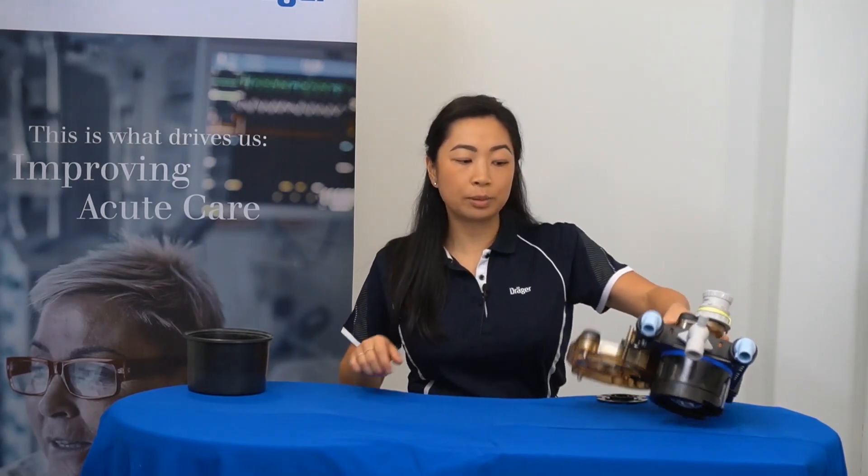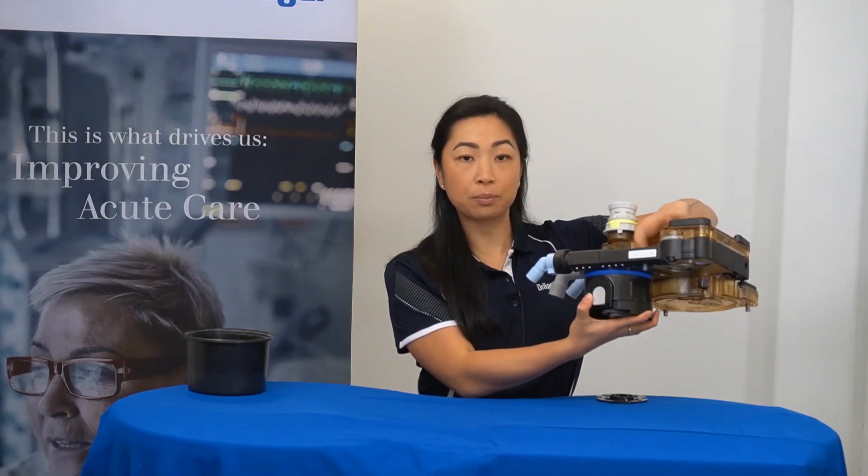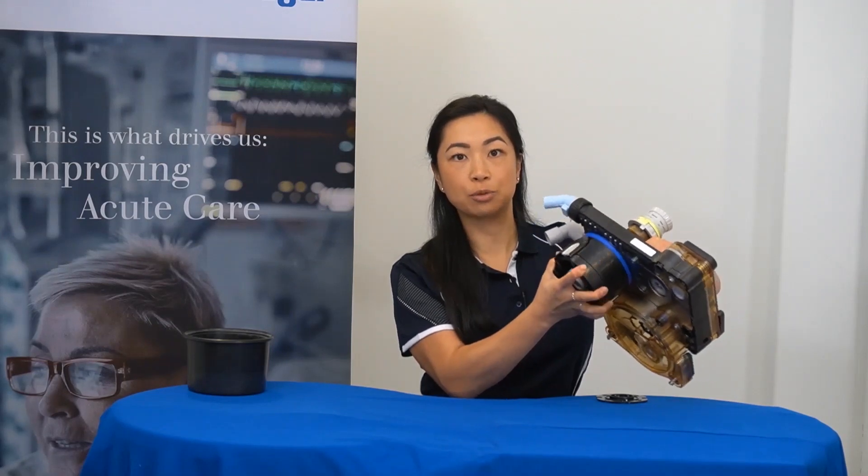To begin, we'll be removing the click adapter from the underside of the breathing block. Ensure a firm grip on the breathing block and on the click adapter with both hands. Then, an anti-clockwise turn to remove the click adapter.